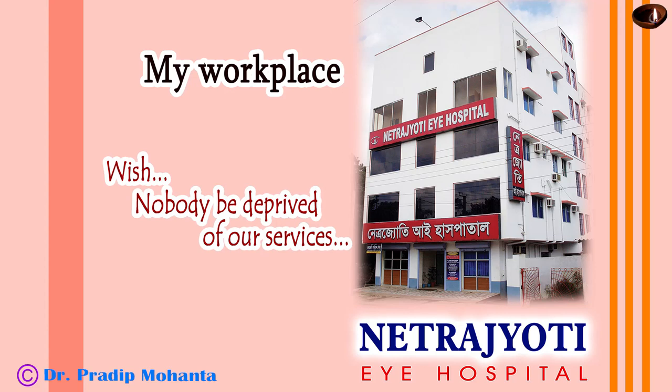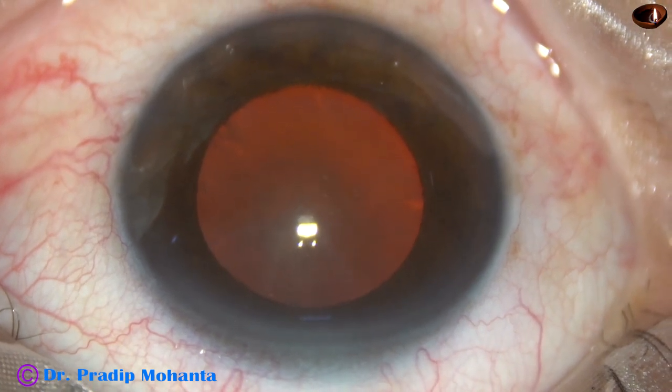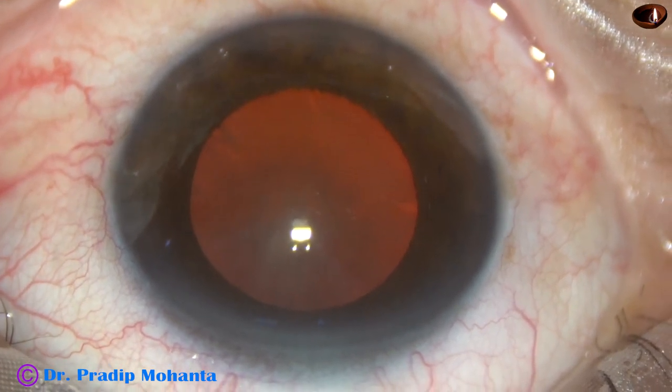Friends, welcome to my workplace at Ranaghat, West Bengal, India. This is a hard cataract. Nucleosclerosis is about grade 5. Let us observe this surgery.